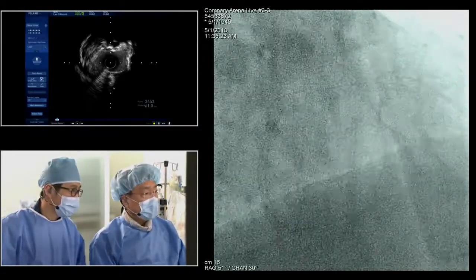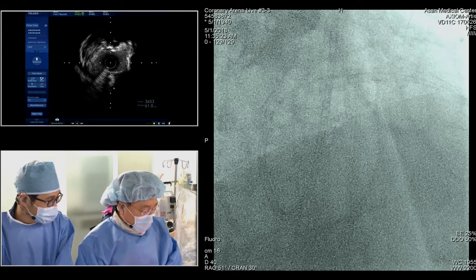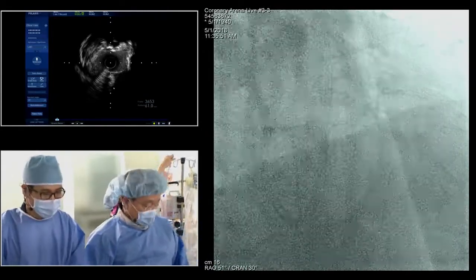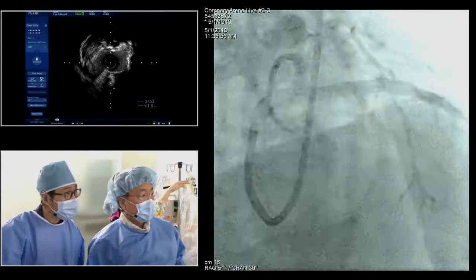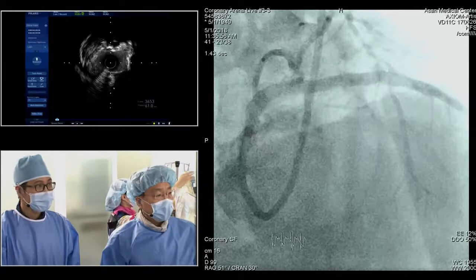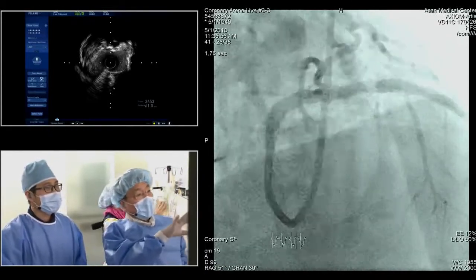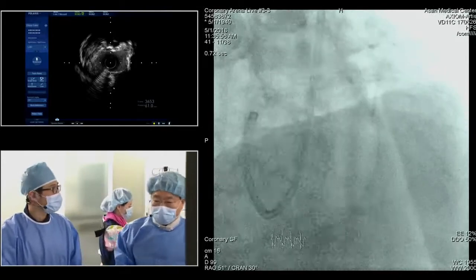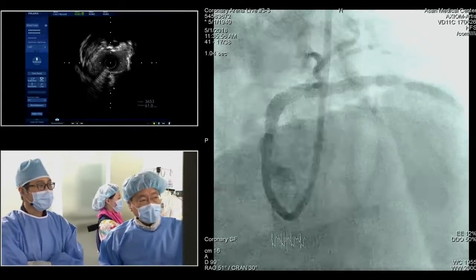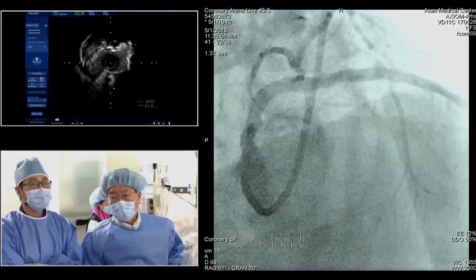However, I don't want to rescue the diagonal branch. The reason is that it is a pretty calcific lesion, it's very difficult to do that. And so, picture, okay, I think the stenting area itself is quite enough. However, angiographic findings are still, so we need more expansion, depending on Dr. An. Anyway, you mentioned the debulking. It's good if we can use DCA-like devices for the ostial part. Absolutely, sometimes we do DCA first, and then precalcific lesion.